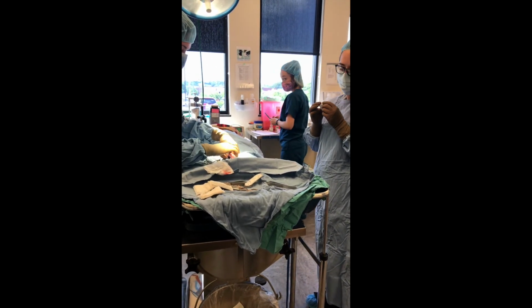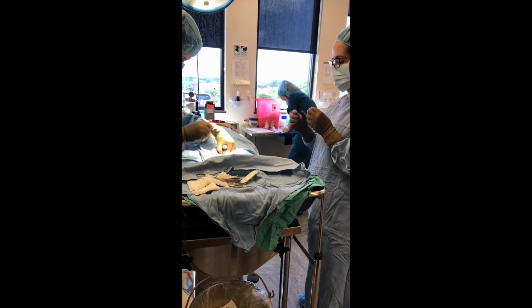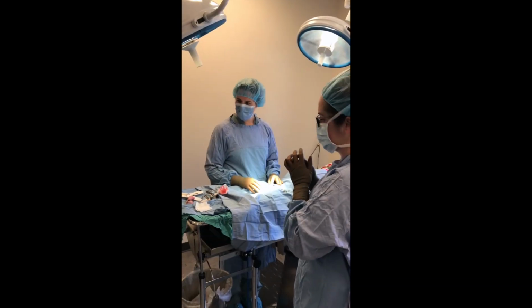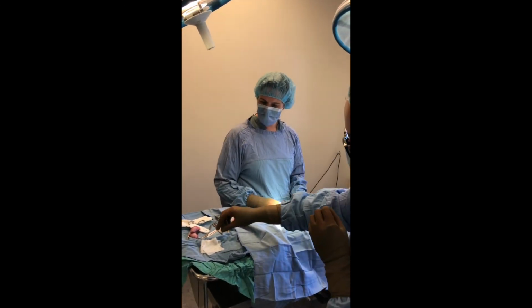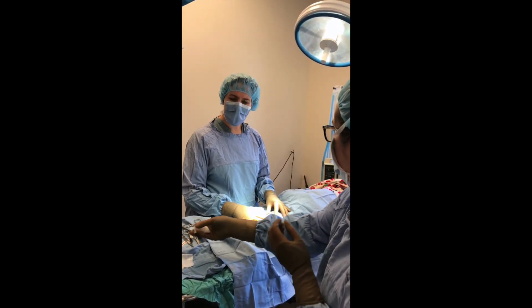Actually, the forceps would be great. So I'm going to show moistening of the tissues. We have some sterile LRS. Do you want it blotted or dripped? I'll blot it.